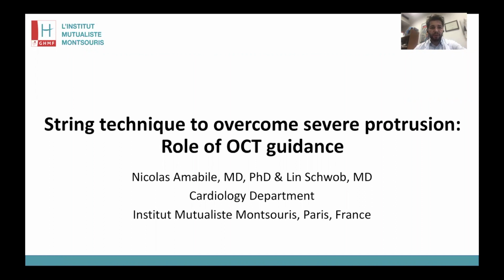This is really my great privilege to present this case entitled String Technique to Overcome Severe Protrusion, the Role of OCT Guidance. This case was prepared with the collaboration of Dr. Schwob from Paris, France.